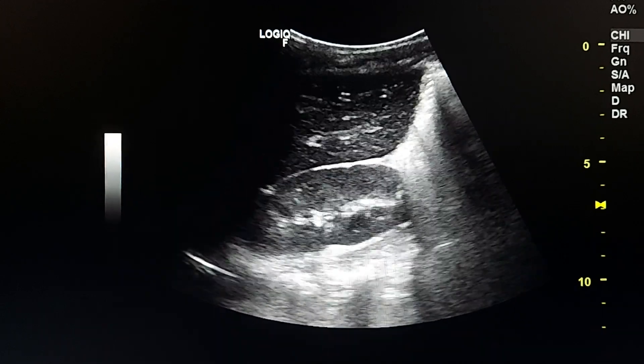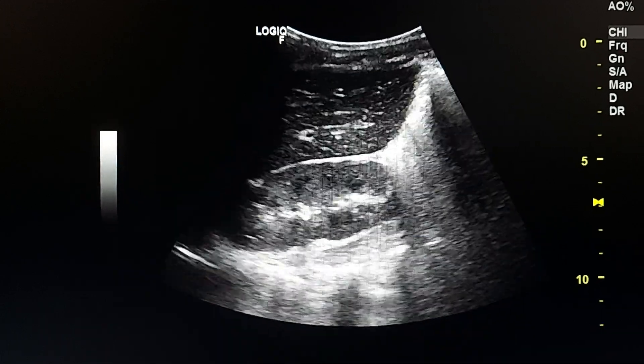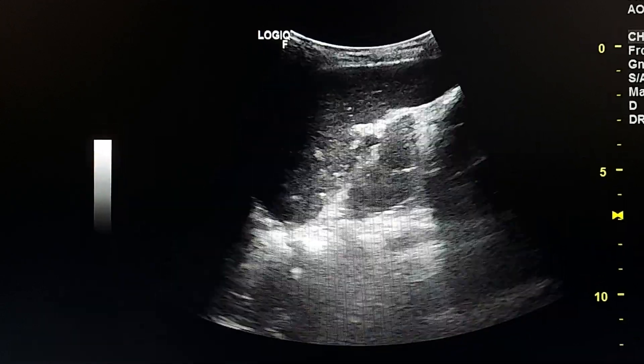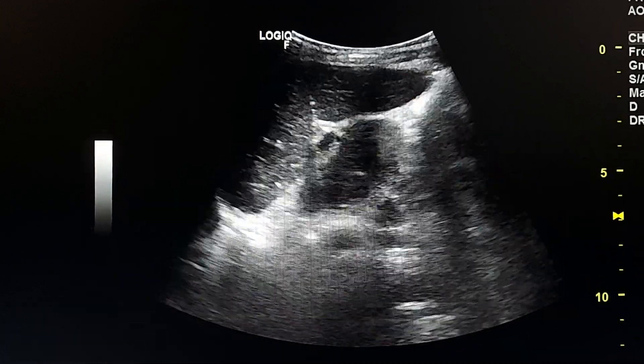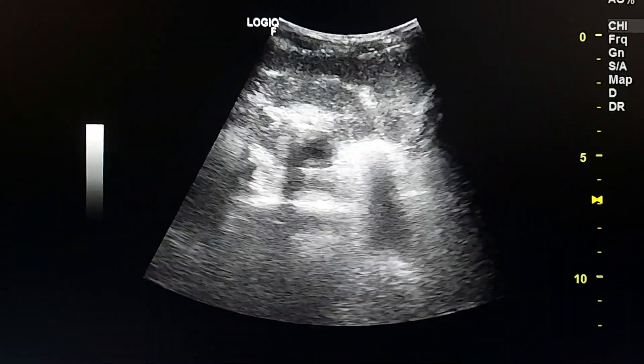This is the liver and right kidney. Normal spleen and left kidney.